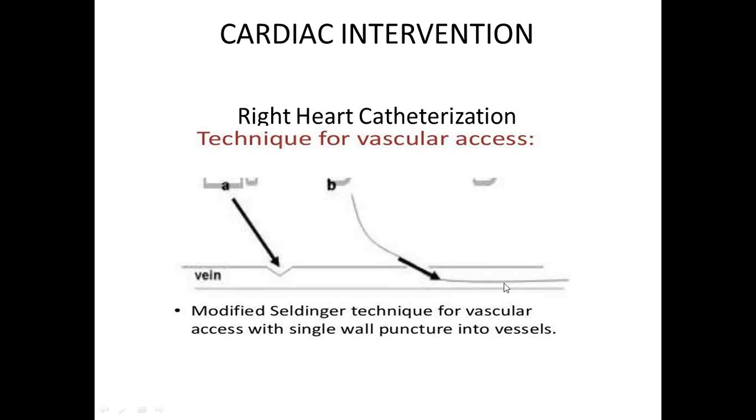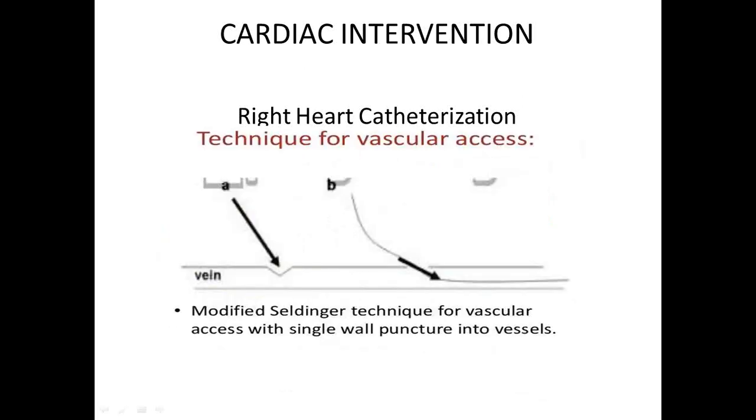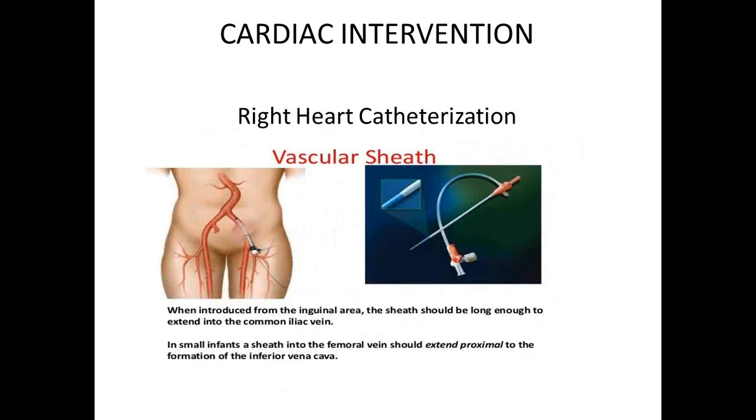The guide wire is very small. It's very flexible, and it should be something that's non-traumatic. It should preferably have a curved end, so you don't puncture the vein. So you advance your guide wire through the needle into the vein. Then you remove your needle, and over the guide wire you put a plastic tubing, and we call that a sheath. So your sheath looks like this.